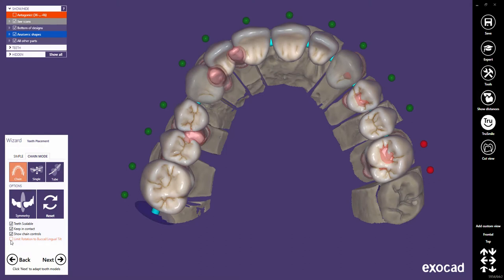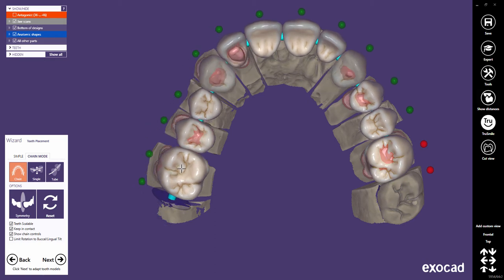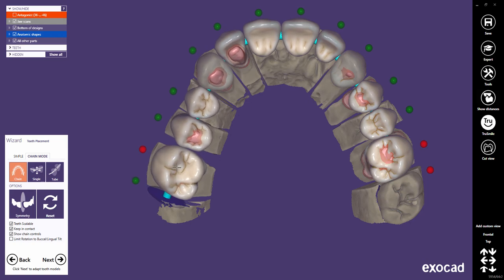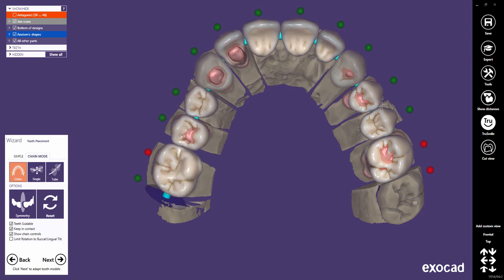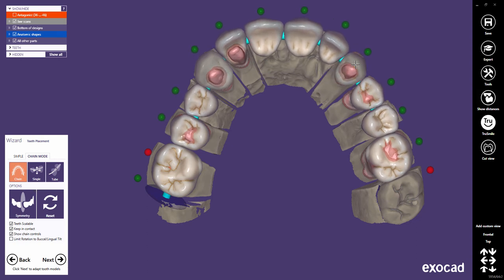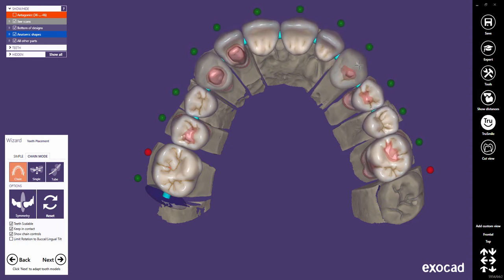The undermost checkbox will limit the tooth rotation to buccal-lingual tilt, which will be shown later in this tutorial. In chain mode, you have the same options for tooth placement as in simple mode. Use the left mouse button to move parts of the chain. If there is no adjacent, you may also lock the last teeth of the chain first. Use Ctrl and the left mouse button to rotate parts of the chain. Note: if a tooth is pinned, it can still be transformed when selecting it directly, but it is protected from being influenced by neighboring teeth's movement. Use Shift and the left mouse button to scale a single tooth in the chain if both ends of the chain are pinned.